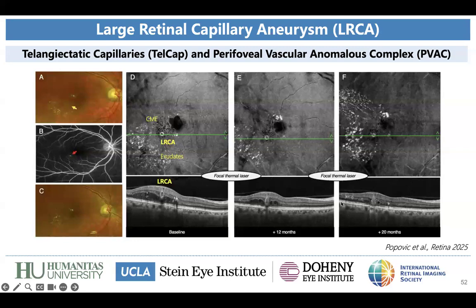So totally agree, no need for dye injections in these patients. Also, with the injections the leakage makes it kind of fuzzy to identify some features, and then with en face it's clear, crystal clear.